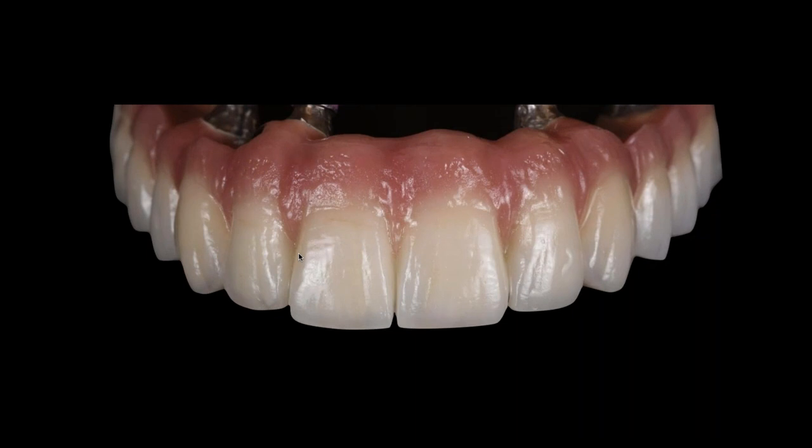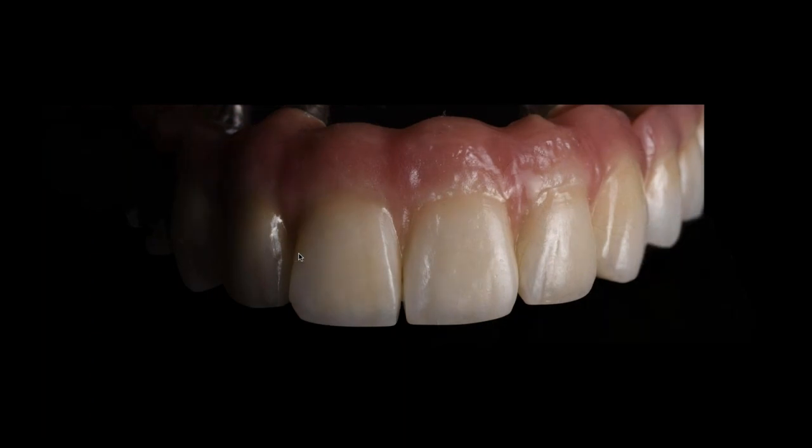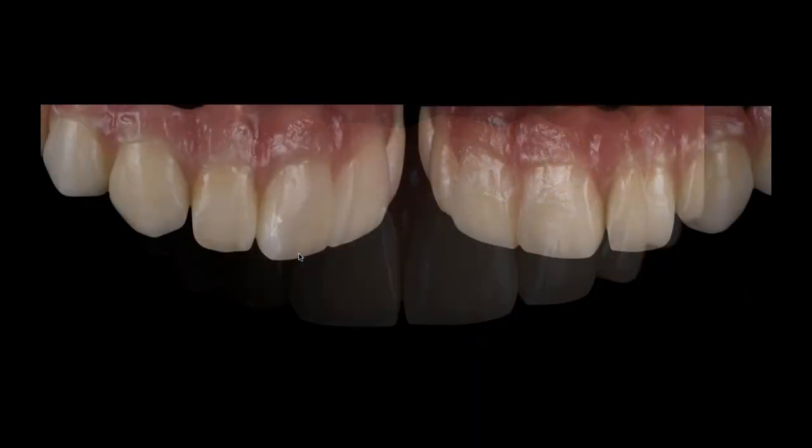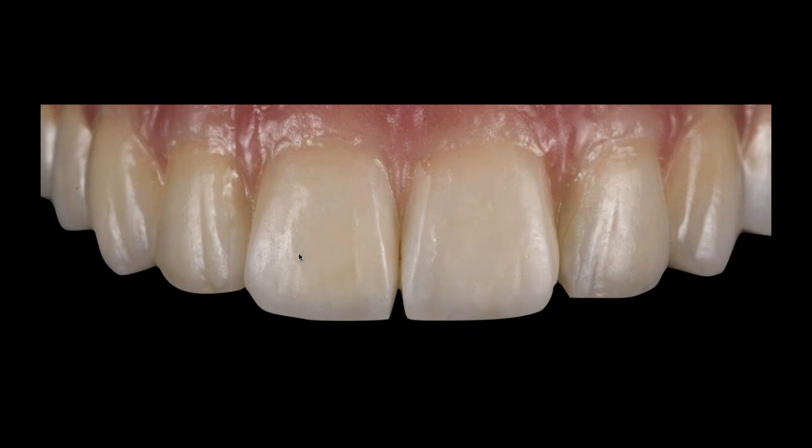I'll final glaze that. It was an older patient, so I wanted a more colorful chromatic tooth with a little bit more natural appeal to it, a little more of a masculine appeal to it. So some sharper angles on the cuspid, some flatter incisal edges along the path there. And then we'll finish off that case and place that in the patient's mouth. And here is our final. And there he is. So he feels a little better and happy, and it worked out fine.